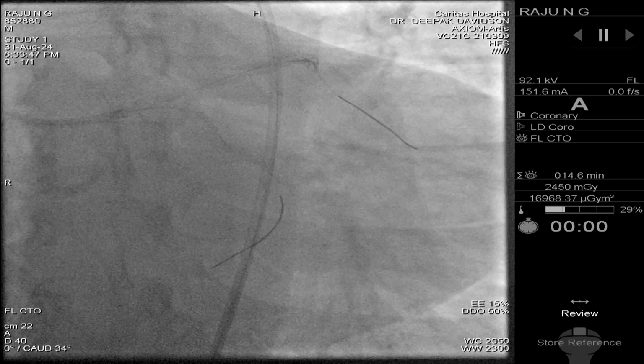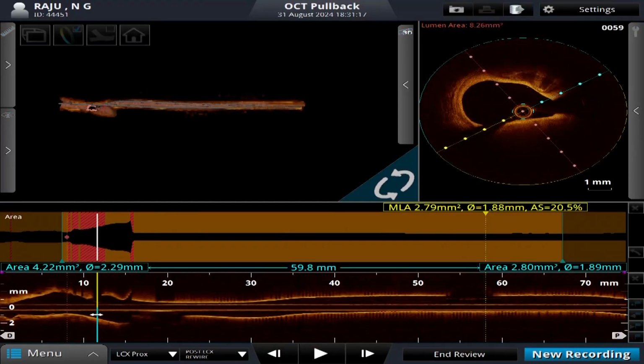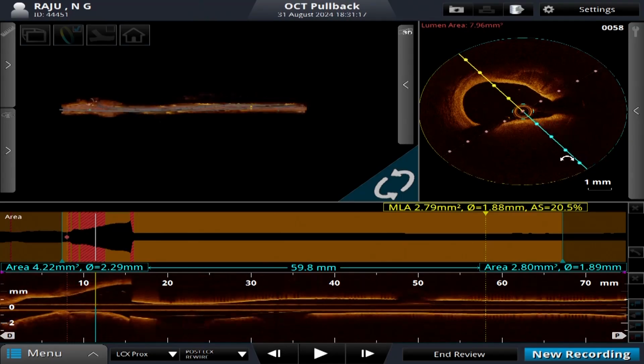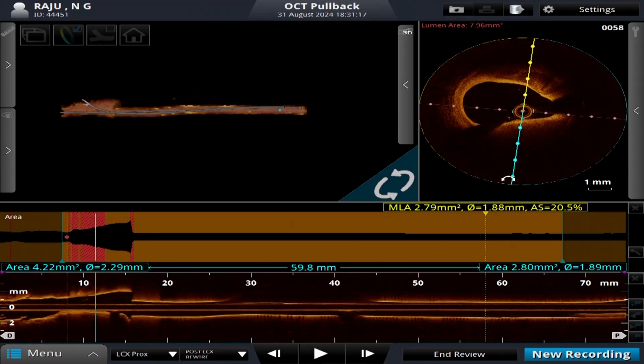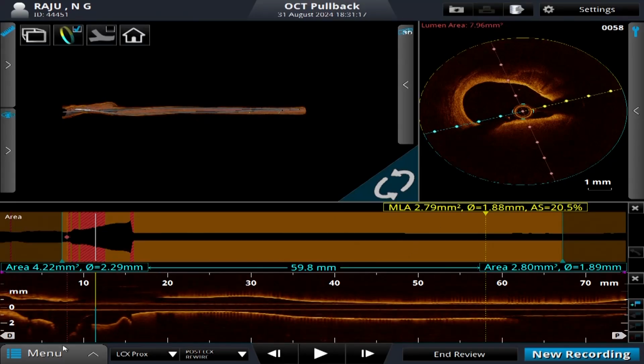Arya, can you again show that longitudinal view and show us that the stent crush is good? No, not this. Rotate it. Show the circumflex ostium clearly. Come down. Rotate it once again. 180 degrees. Rotate, rotate. Okay, okay. Now we are seeing the circumflex.